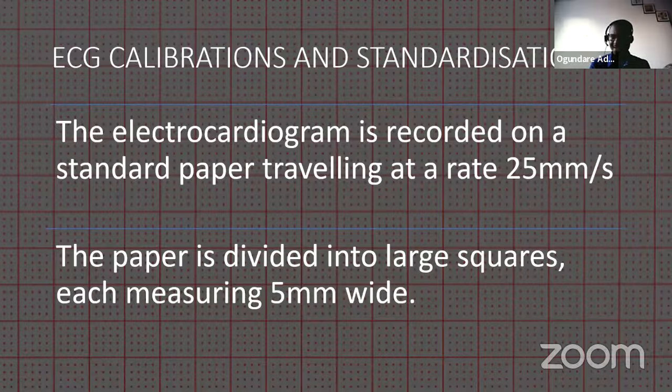This is the real part of ECG interpretation. If you don't understand this aspect, then I'm afraid it's going to be extremely difficult for you to understand ECG interpretation, because most of the things you'll be looking for will be in ranges, and they'll put the range down for you. For example, if the PR interval is prolonged, how will you know it's prolonged?